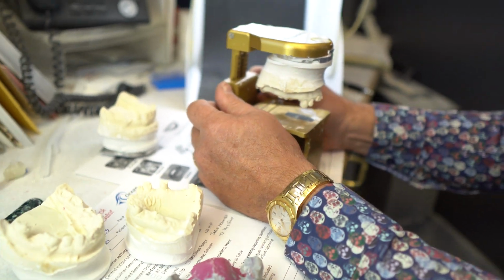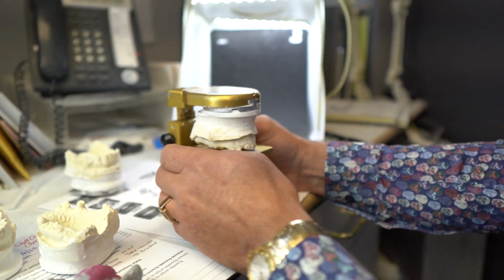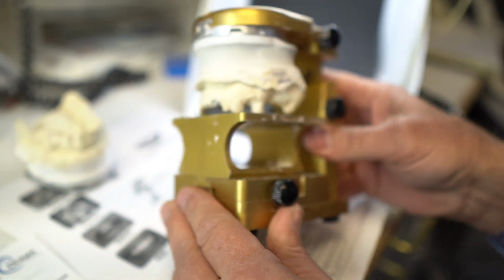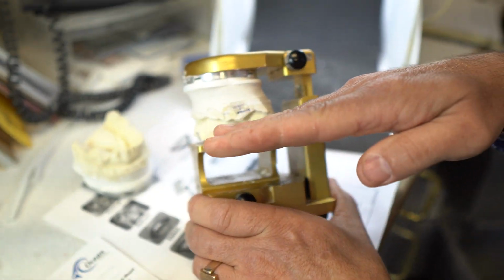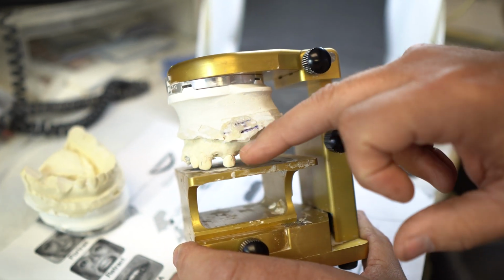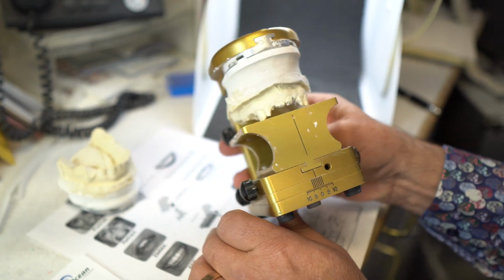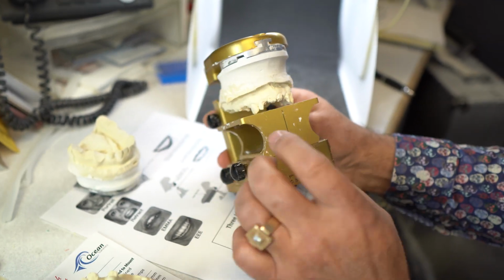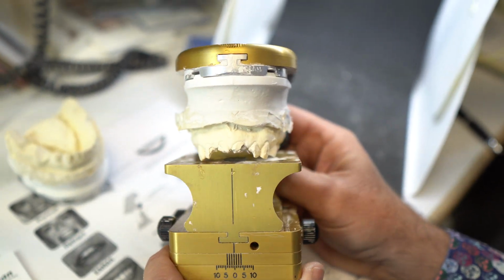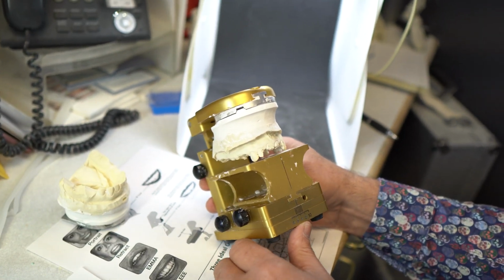So we had to resort to the picture to make sure that we had a very close to accurate horizontal, okay? But the wild card was the pitch, okay? The pitch being this of the maxillary. Now, fortunately, we got a cuspid, a bicuspid, and a destroyed molar back there that's off the table. But you can see how they line up, the two canines, very, very closely. And now we've got something to work with. And this is for an immediate denture.